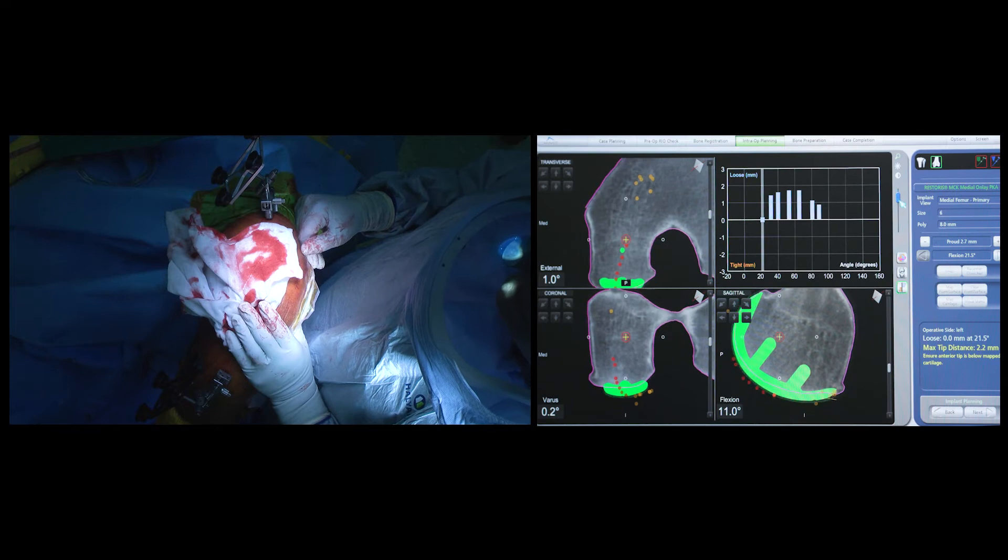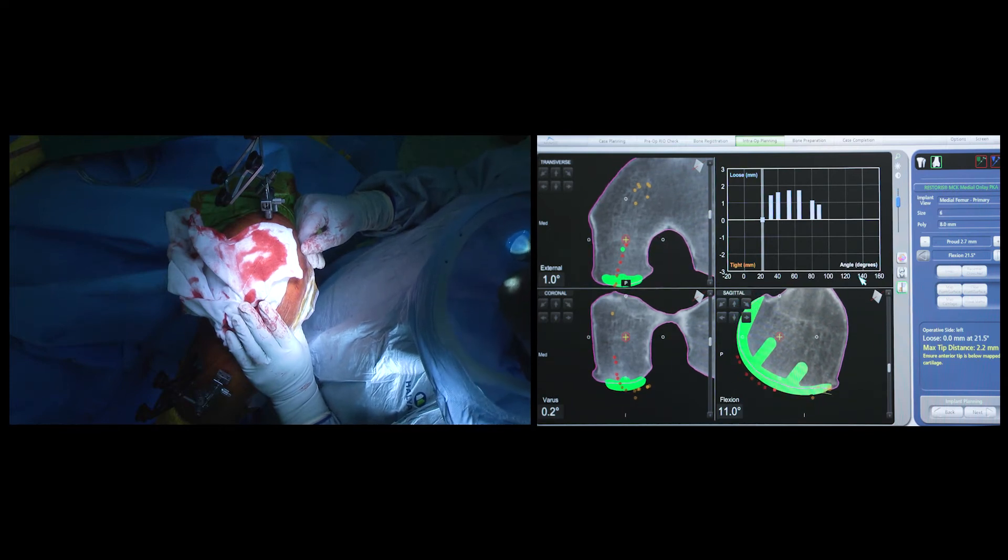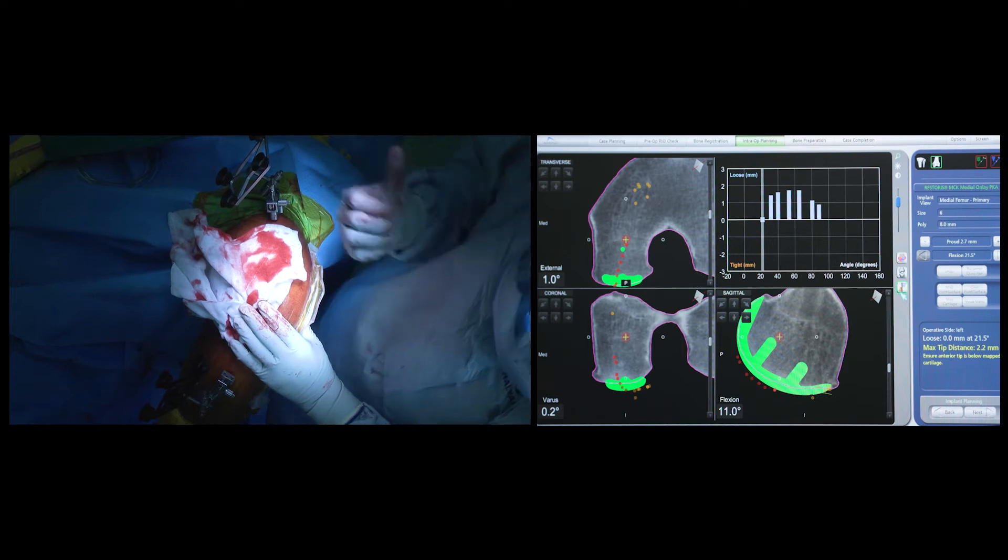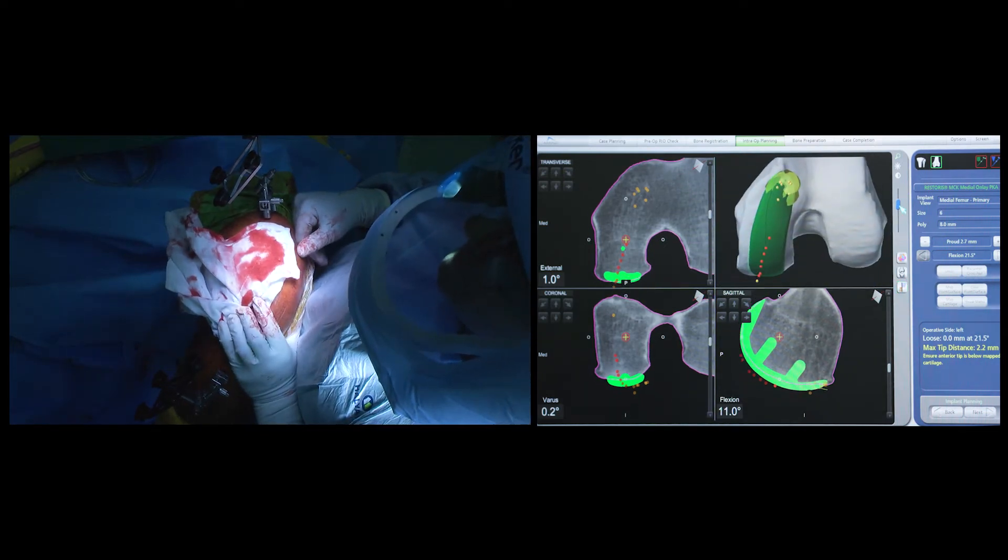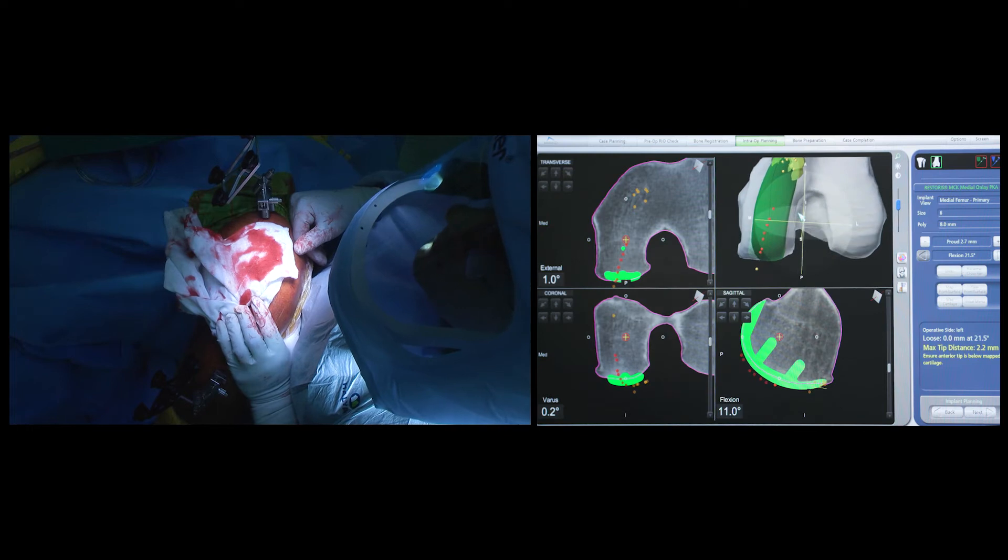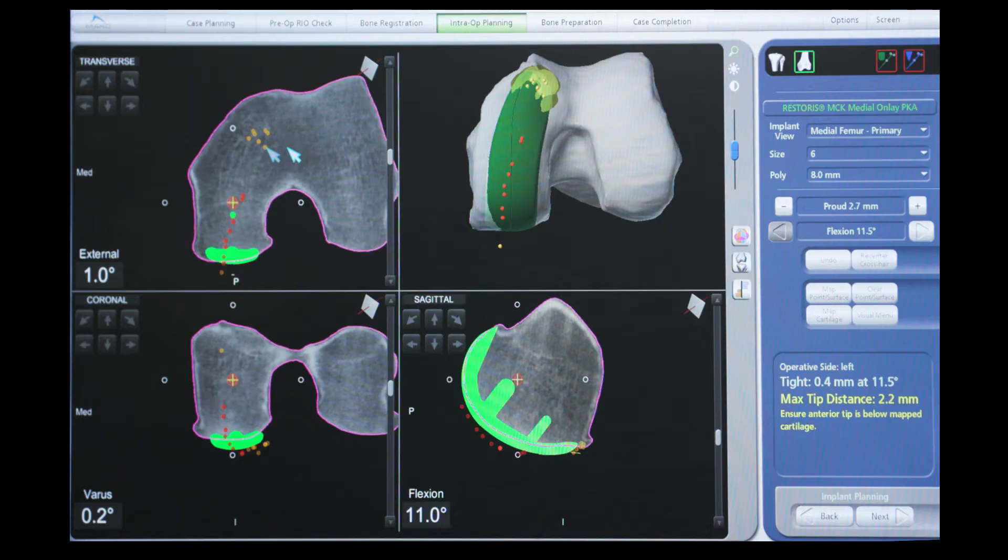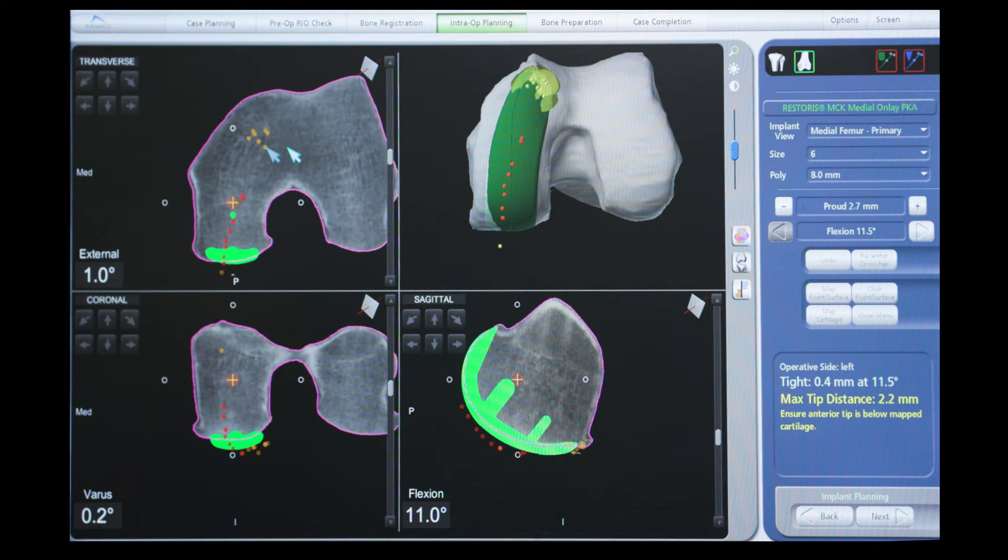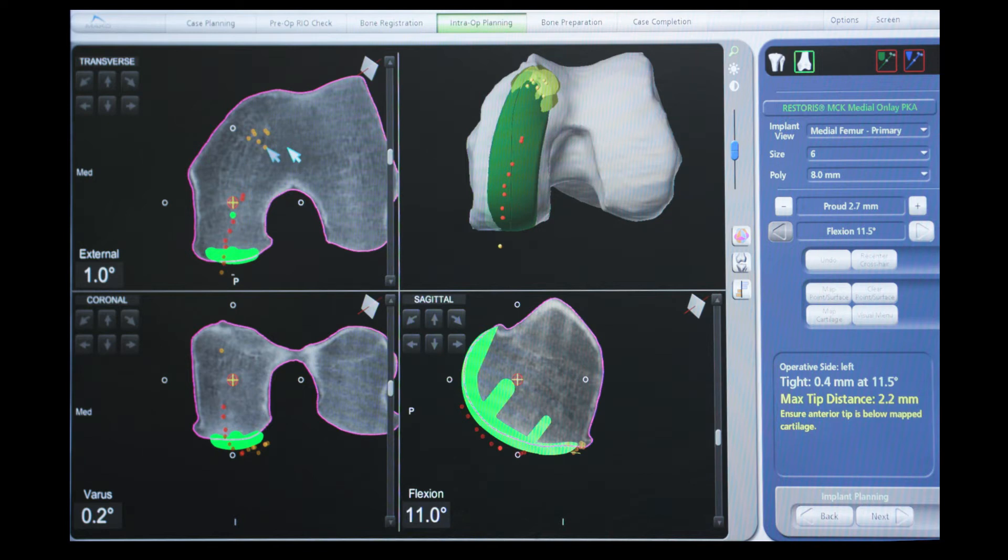This process of making adjustments and checking the ligament can be repeated as many times as necessary until the surgeon is completely happy with the final ligament tension and prosthetic sizing and alignment. Another unique feature about the system is that the computer-generated virtual model can show us how the tibial and femoral components are gliding and tracking past each other. The more closely the red dots are matched to the faint black line on the mid-portion of the femoral component, the more ideal the tracking of the components and the more even distribution of forces on the polyethylene insert, which in turn reduces wear and improves longevity.